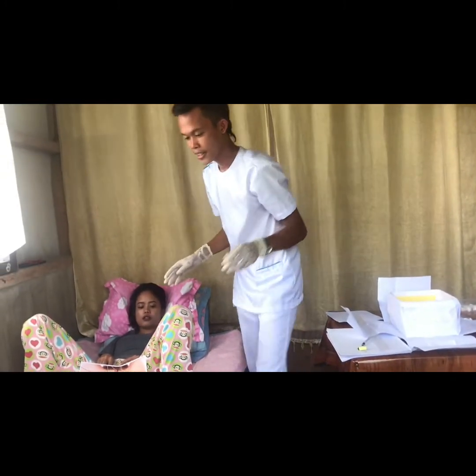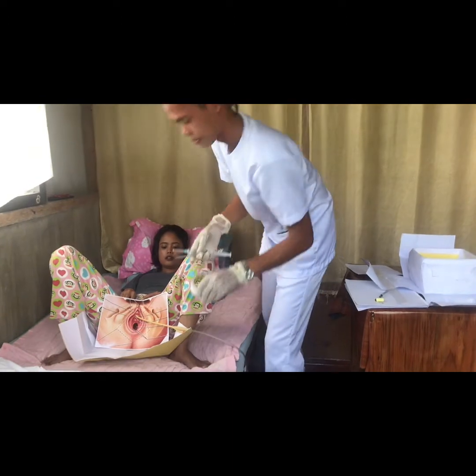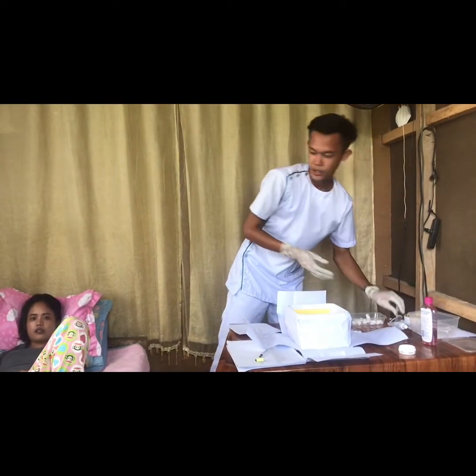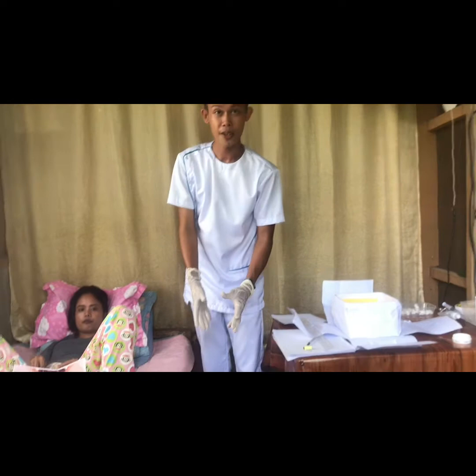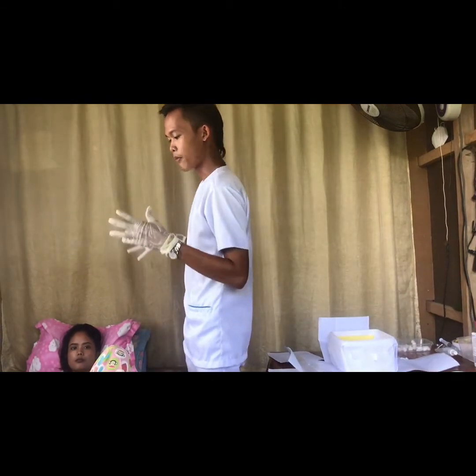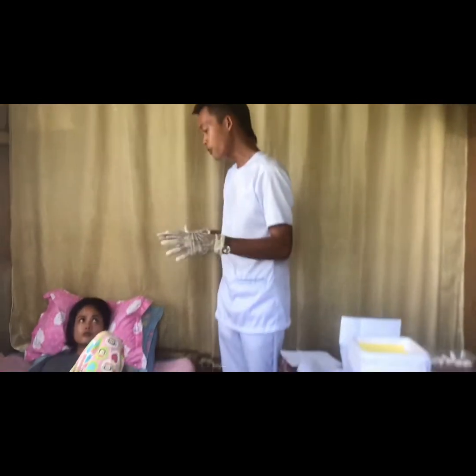Okay, so for this time, I'm going to collect all the equipment that I have used. You okay, ma'am? Yes. Okay. So after, we have to place the urine bag of the patient on the side railing of the bed. Before leaving the patient, we are going to ask her if she is comfortable. So ma'am, are you comfortable now?